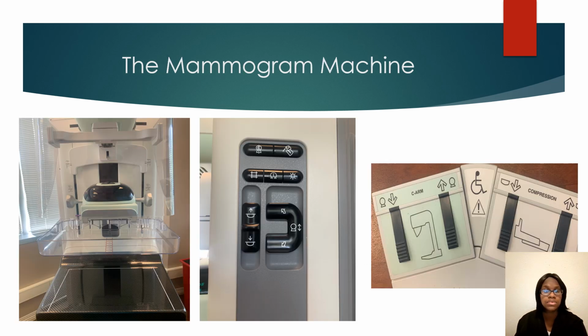And then also, these are the images that I took at my job. So you have the mammogram machine. This is pretty standard. I've seen or heard of a lot of facilities using this equipment. So you can see a better picture of the face shield, the compression paddle, and the detector. You have your buttons that you can turn right to left, and let it up and down. You also have your foot pedal. So this is pretty cool.